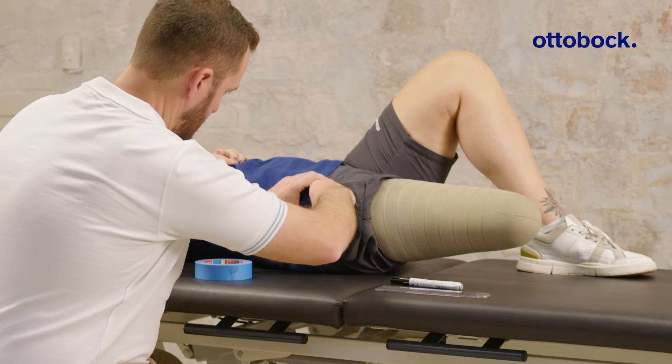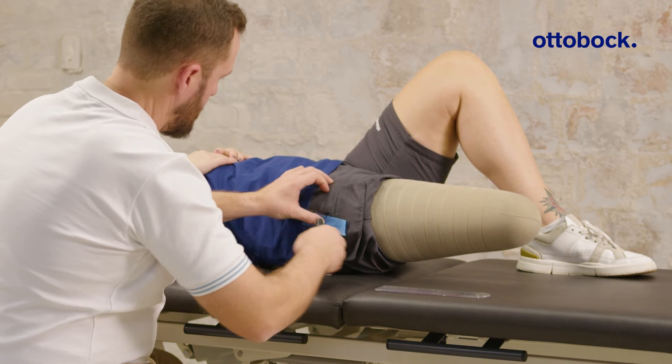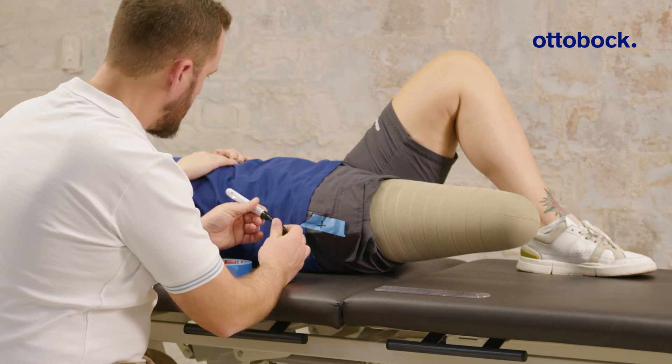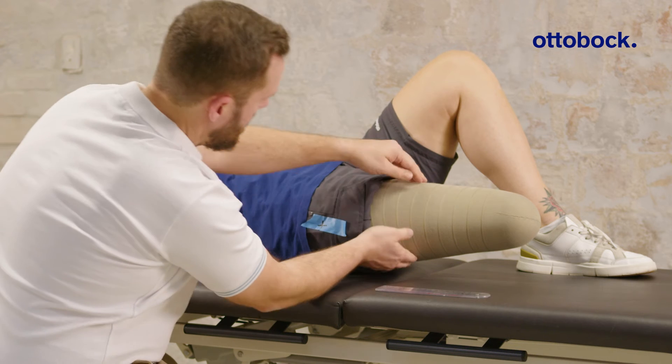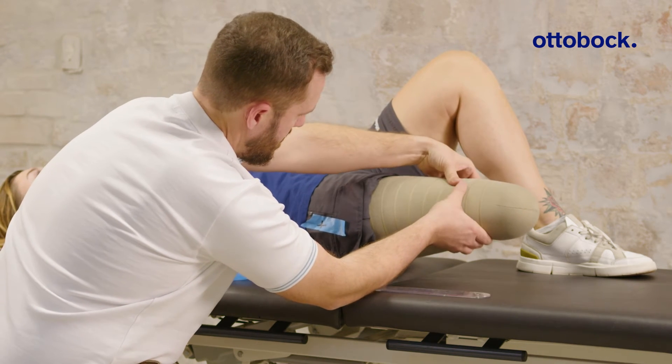First, determine the hip pivot point in the sagittal plane. Locate the top of the greater trochanter and mark it. Now locate the femur and mark it using adhesive tape.